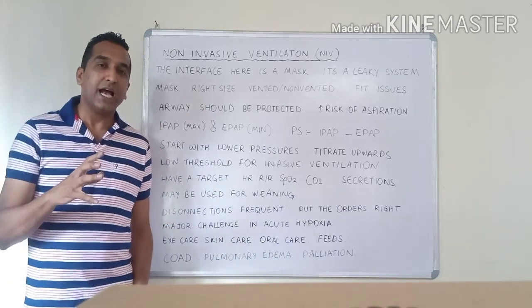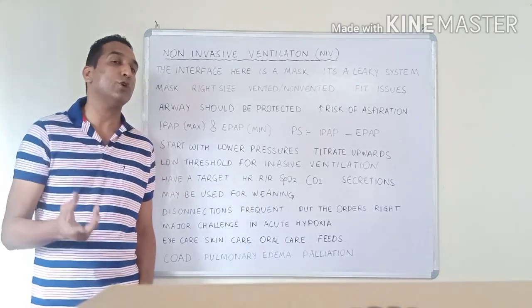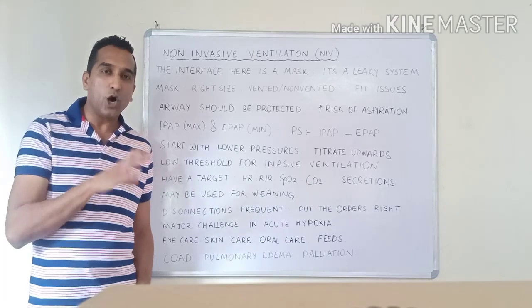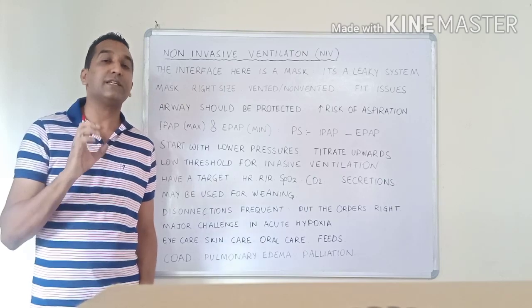So nurses take a big role in non-invasive ventilation also because they frequently disconnect and communicate with the patient. So you should be well versed with the use of NIV, and all units who successfully use NIV have a support staff which does an excellent job.